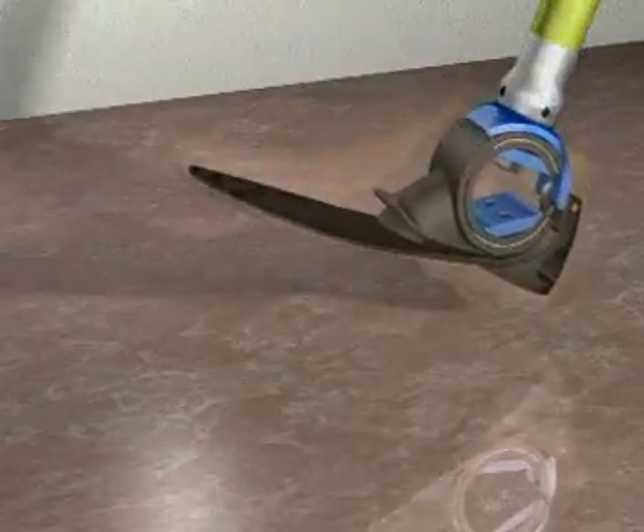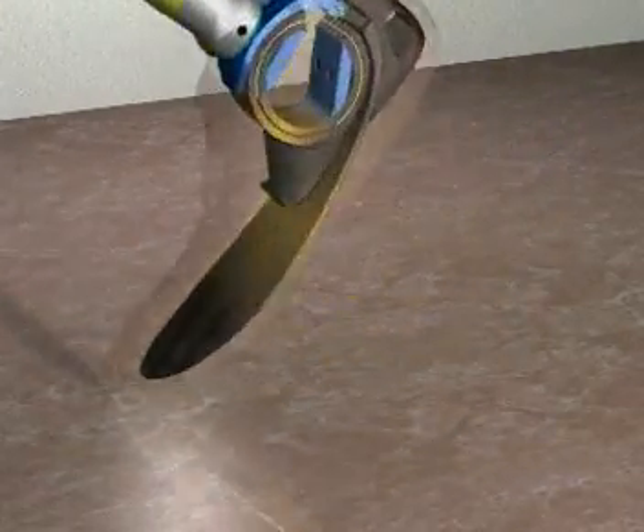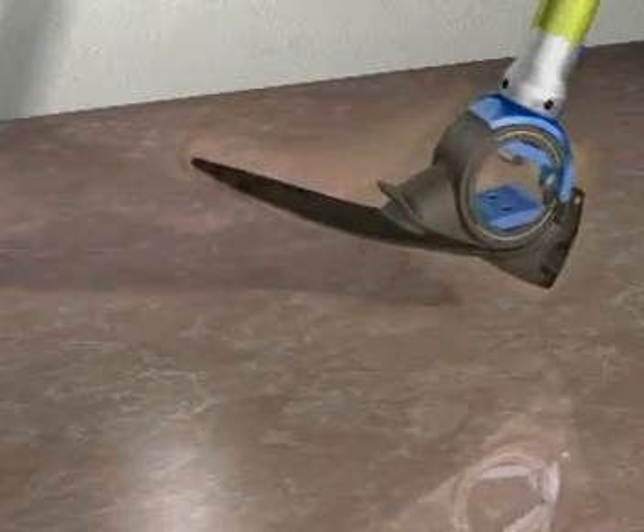The yellow path shows the energy flow within the sea spring and dorsiflexion spring. During loading response, the sea spring is automatically compressed. Following foot flat, this stored energy is released during mid stance.